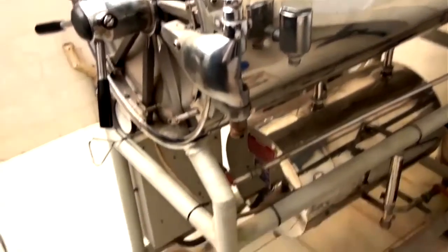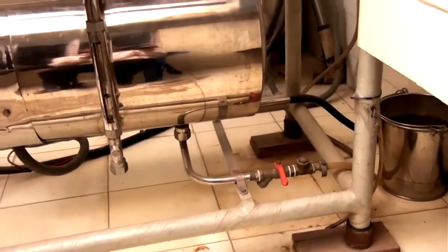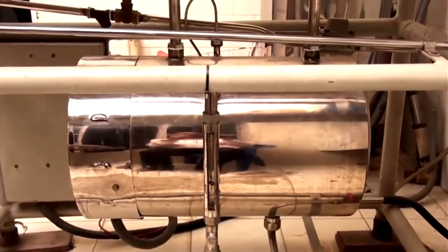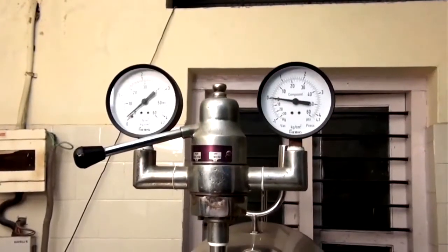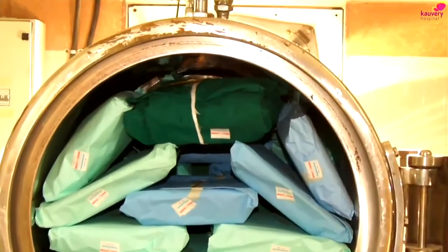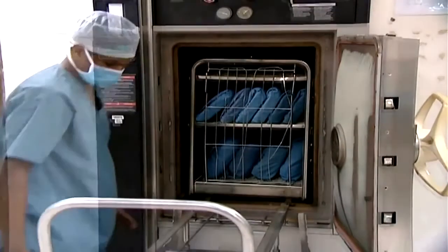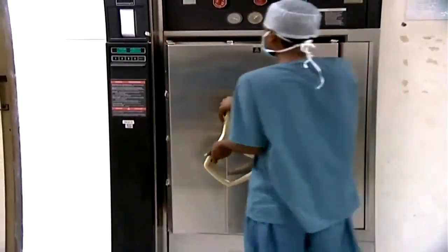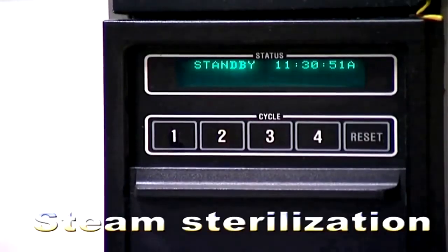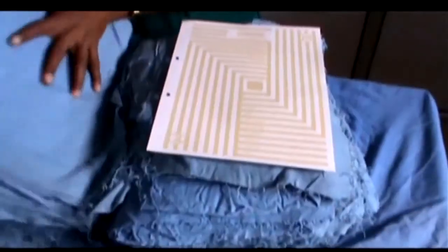Now, in the previous session also, they were talking about autoclave machines and all. The ideal for ophthalmic use is the horizontal autoclave, which has a separate chamber for steam, which is generated, and the autoclave chamber is pre-vacuumed. And the best thing is to have an individual pack for individual surgery, like this. So you have the bigger machines, which are more automated, which will take care of all the cycles. We need not bother, and it will give you feedback. And vertical autoclave is no more advocated for ophthalmic practice because it doesn't have a vacuum cycle, and it's dangerous.